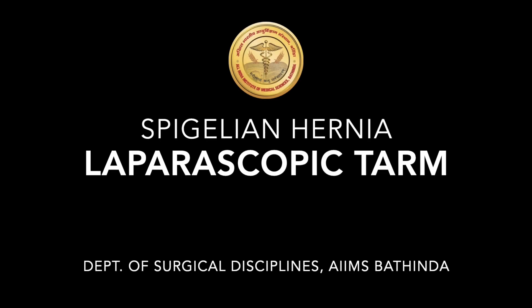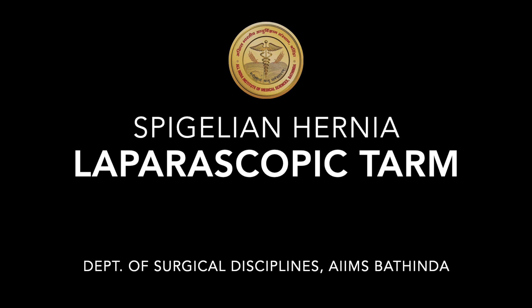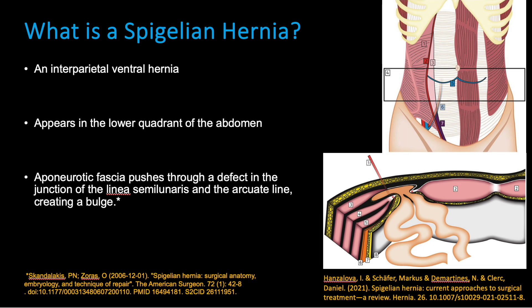Hello friends, this is a video demonstration of a Spigelian hernia treated by laparoscopic TARM. Spigelian hernia is a rare interparietal ventral hernia. It appears in the lower quadrant of the abdomen with a defect between the linea semilunaris and the arcuate line. The external oblique aponeurosis is almost always intact.